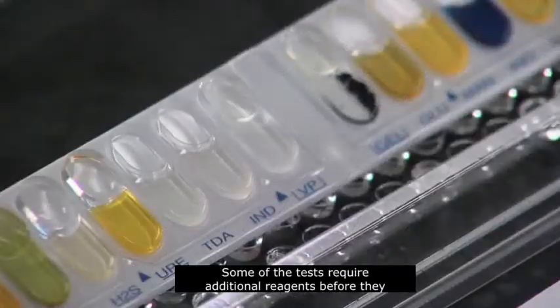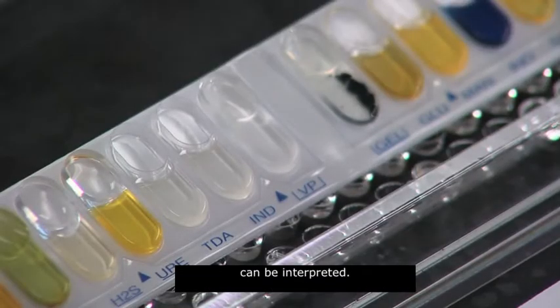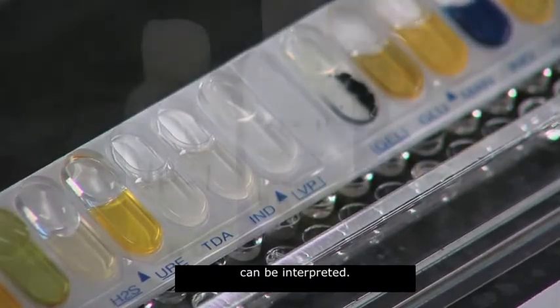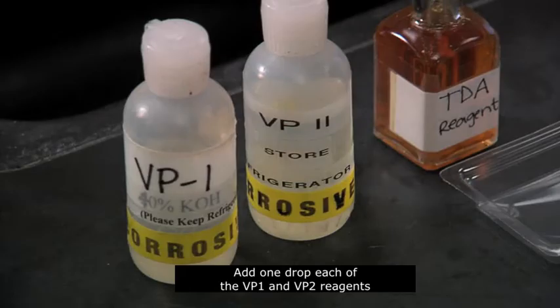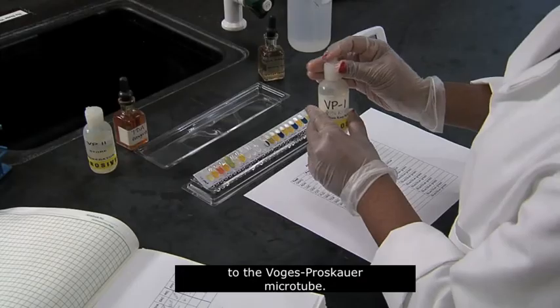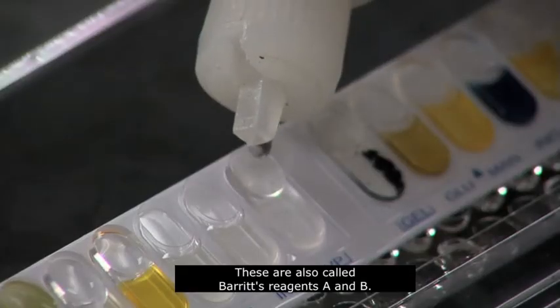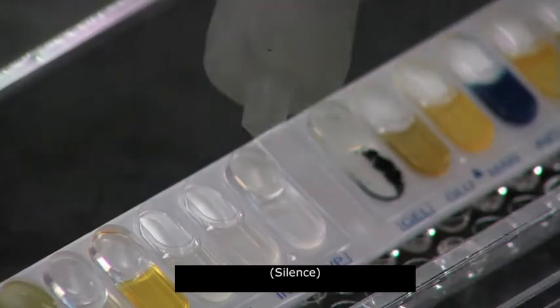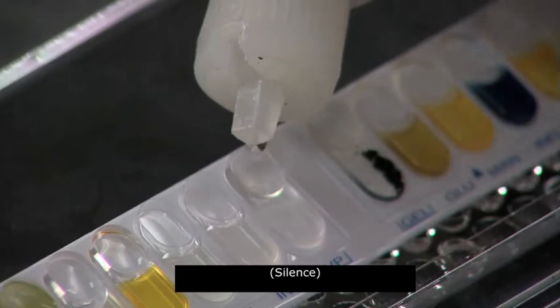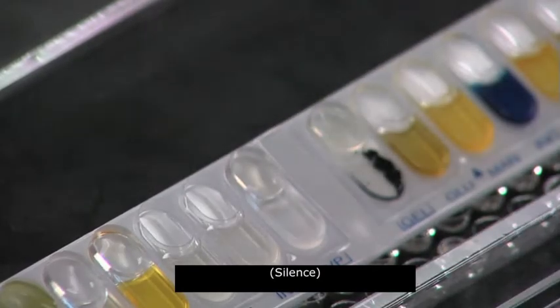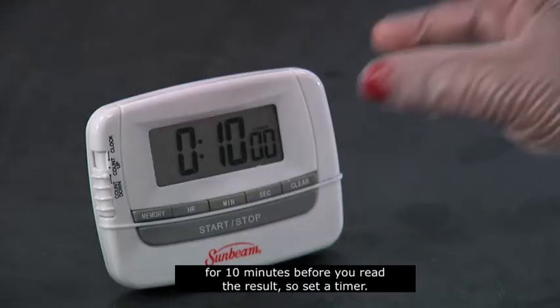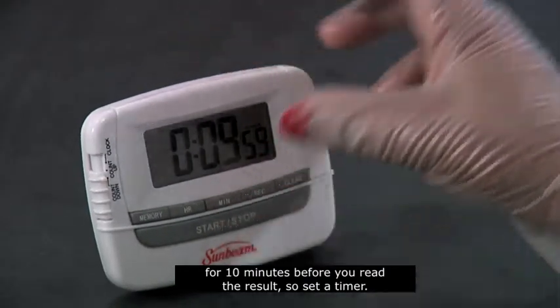Some of the tests require additional reagents before they can be interpreted. Add one drop each of the VP1 and VP2 reagents to the Vogue-Proskauer microtube. These are also called Barrett's reagents A and B. The reagents must react for 10 minutes before you read the result, so set a timer.